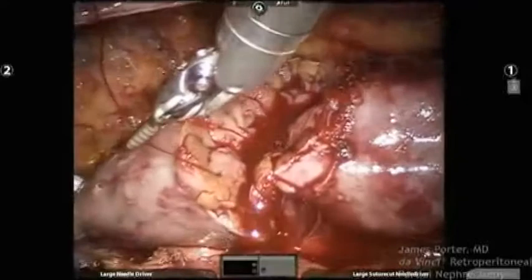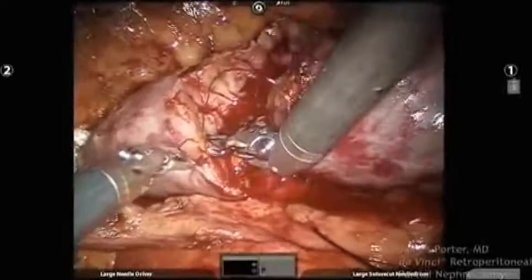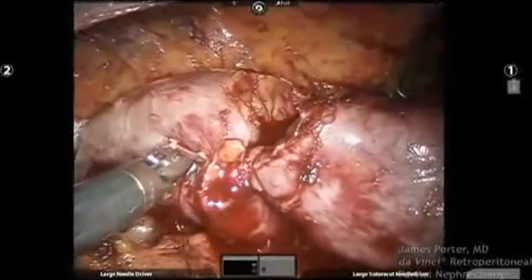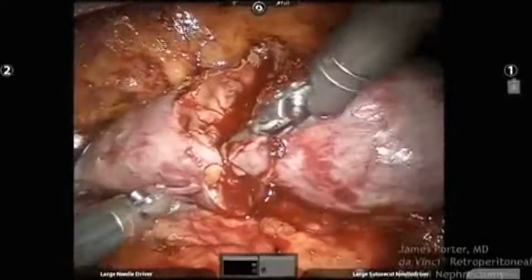You know, a lot of people have gone to this running the base. I will tell you that myself and some of my colleagues, we would probably exclude this step and just do the renorrhaphy. I remember, and correct me if I'm wrong, a lot of this stemmed from the pure lap literature and techniques that were demonstrated at various endourological meetings, when there were some hemorrhage rates with the pure lap approach. I don't know if this is presumably for you guys, who all seem to use this technique, double arm. Do you think this lowers the rate of hemorrhage?